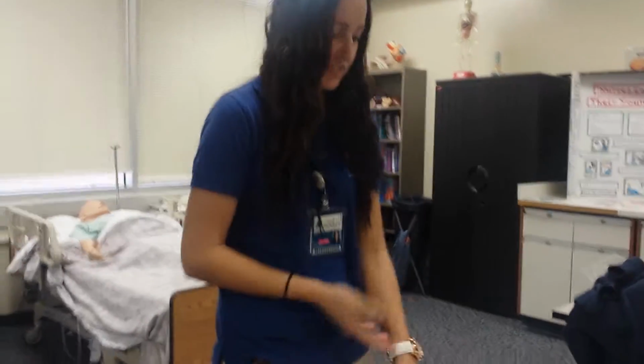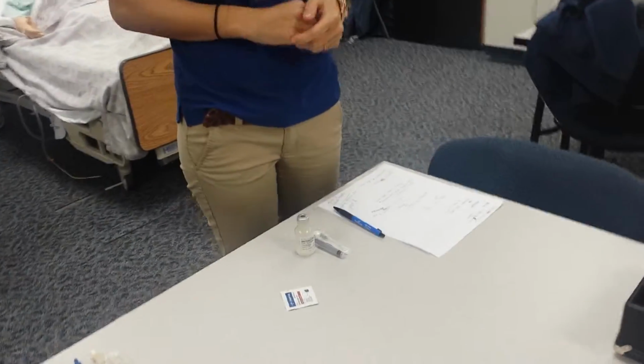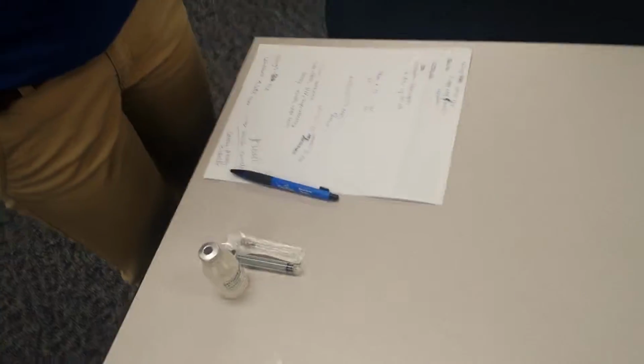My name is Kaylee, and I am going to demonstrate how to hang a piggyback medication onto a primary line. So first we're going to look at our doctor's orders. He wants 500 milligrams of vancomycin, an antibiotic, to run over an hour.